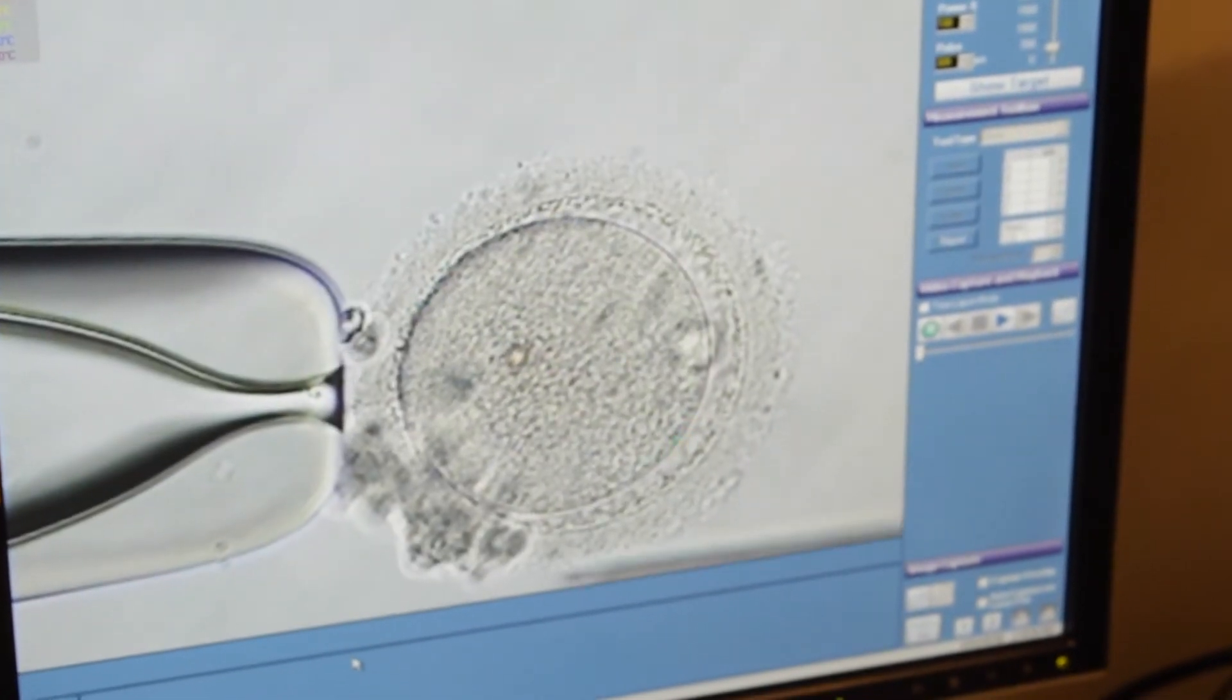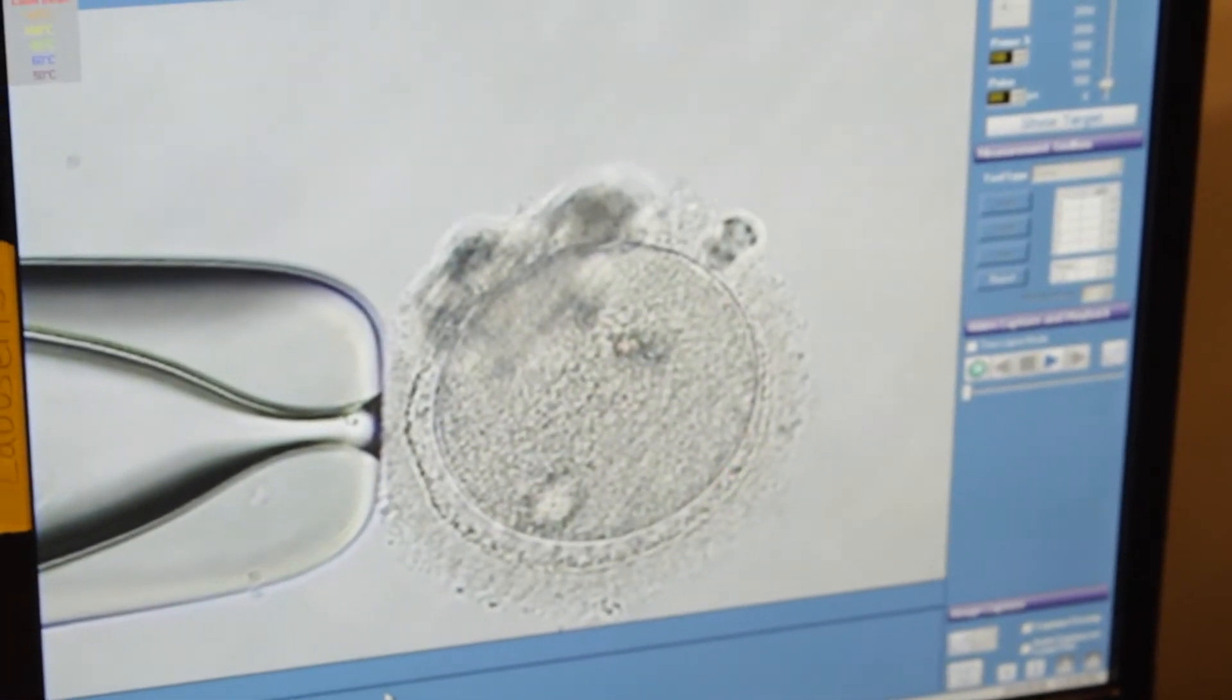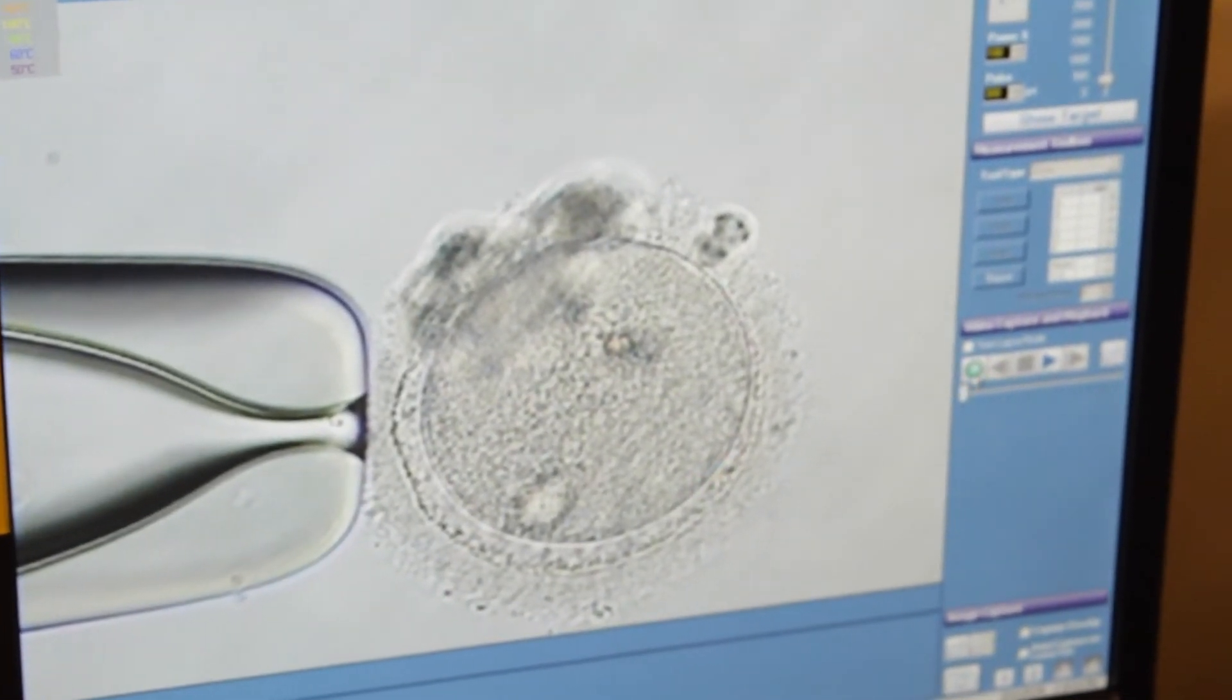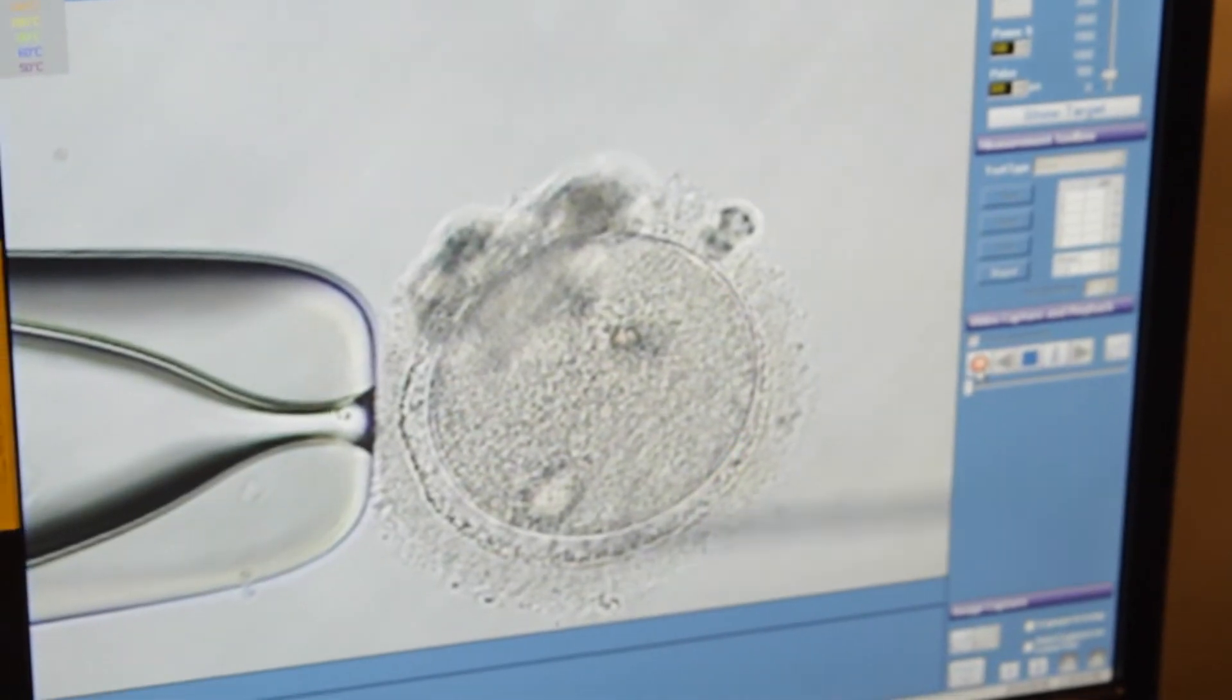Orientation of the oocyte on the holding pipette is very important, and data within our lab has shown that we get the best results when holding the polar body at a 7 o'clock position.